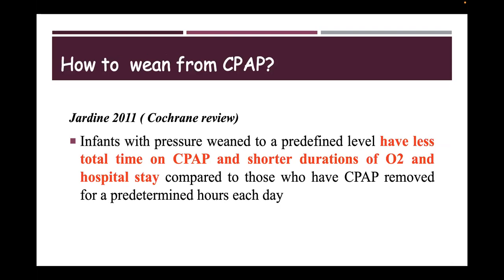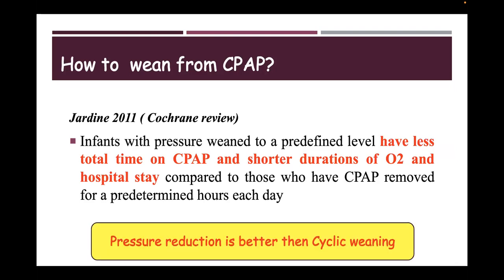When we compare these two methods, the gradual pressure weaning, where we decrease the pressures gradually, is more beneficial. It decreases the duration of hospital stay and duration of oxygen. So pressure weaning is the preferred one.